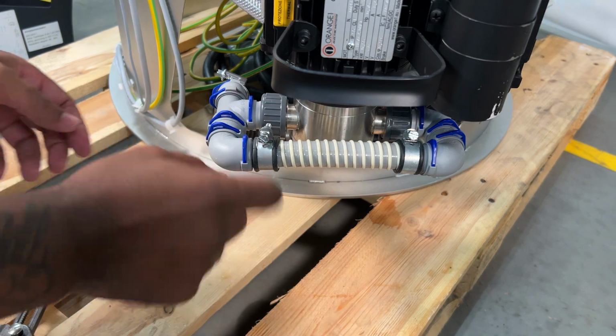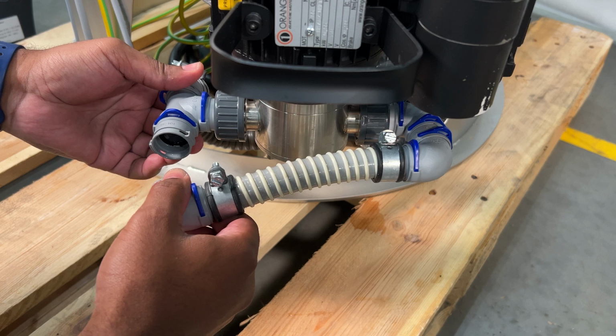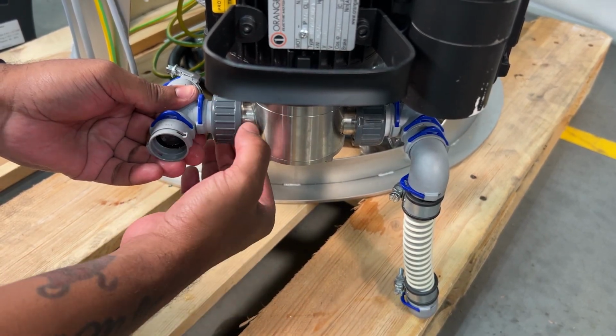Locate the gasket that requires replacement. Remove the blue fitting. Move the hose out of the way. Loosen the gray compression nut.